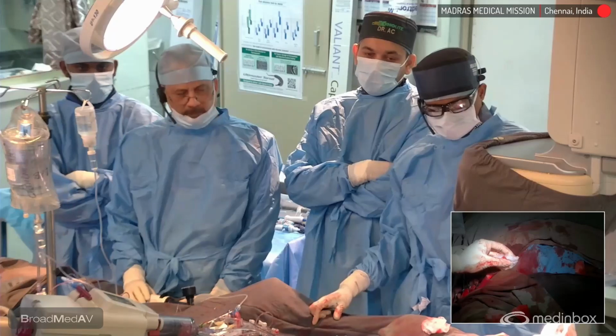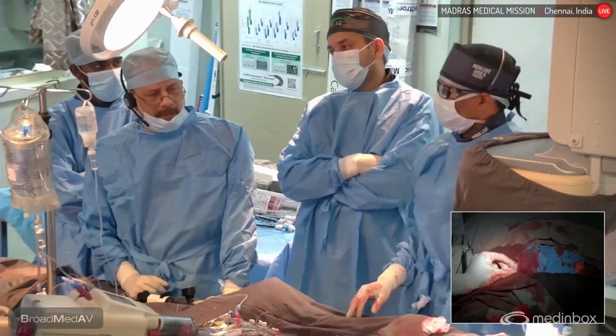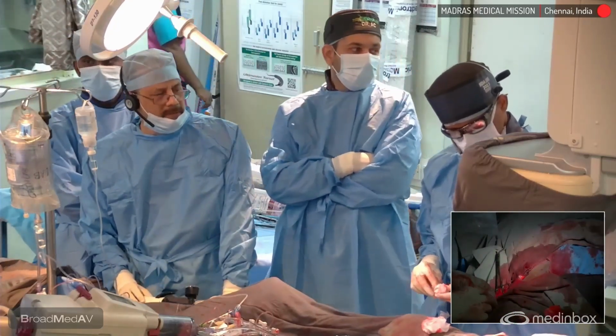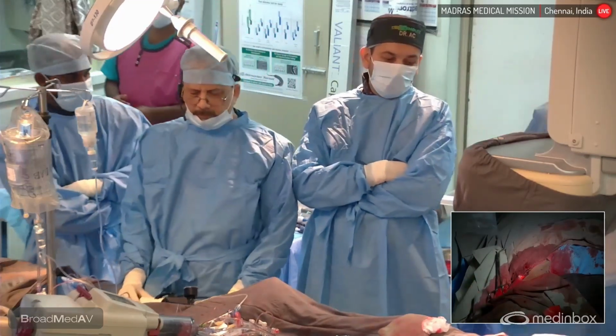Even while calling the surgeon, we can always do a balloon tamponade and call the surgeon, to avoid the panic situation. Now that we have done balloon tamponade, we are not worried about blood loss or hemodynamic compromise. The surgeon also has the time to do the repair.